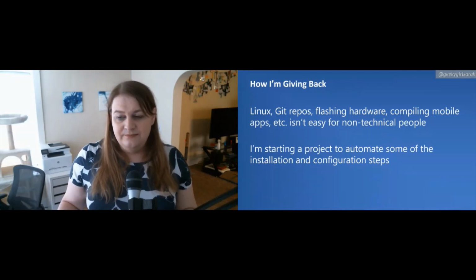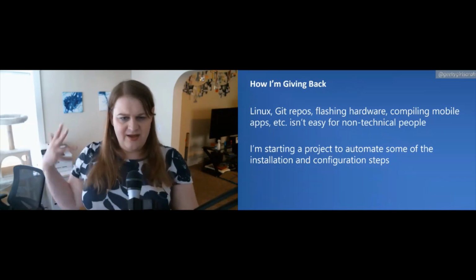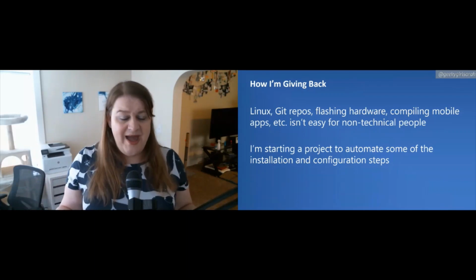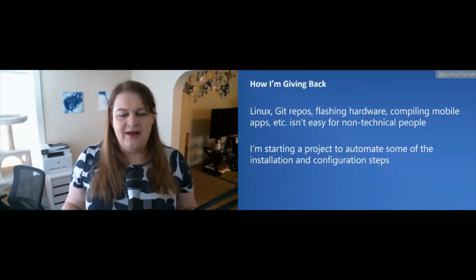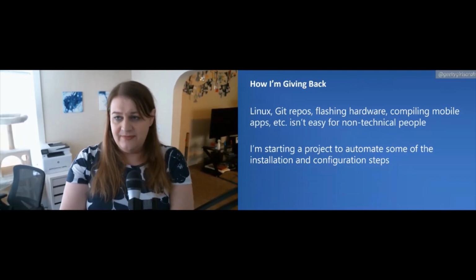So one of the things I thought is all of these things can be automated with a GUI in front. So I've started working on a way to create a cross-platform desktop app that, if you just plug in the device, can flash all the things or compile the apps and do everything in the background that you would have to do manually from a command prompt or things like that.